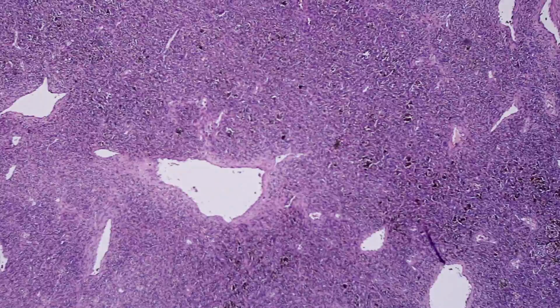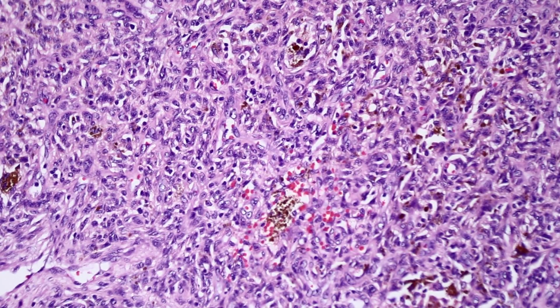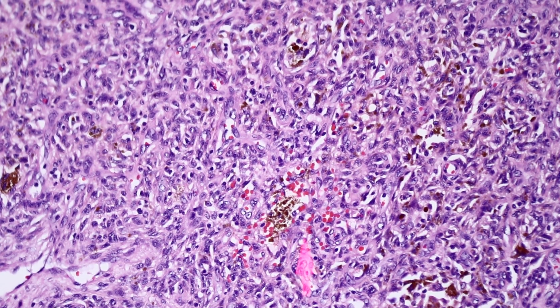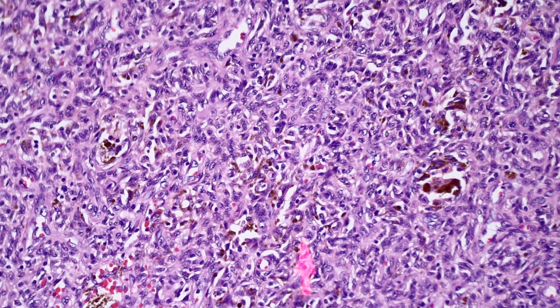The other thing here that you probably noticed already is the presence of abundant amounts of hemosiderin. So here are some little areas of hemorrhage. You can see erythrocyte extravasation. Sometimes there are large aneurysmal spaces. Some people might like to split this and call this a hemosiderotic dermatofibroma because there's tons of hemosiderin but not large cystic blood-filled spaces. I tend to lump that together with aneurysmal dermatofibroma personally.